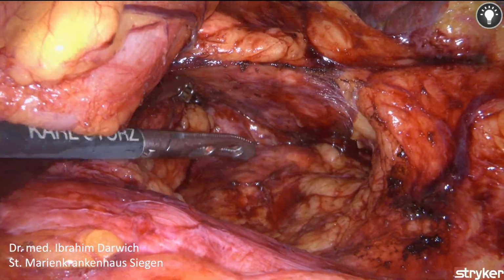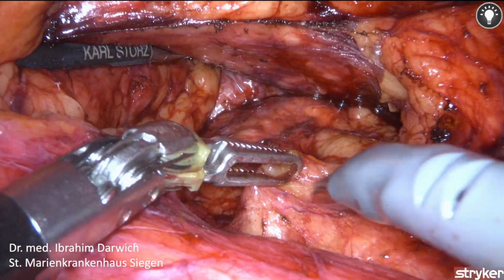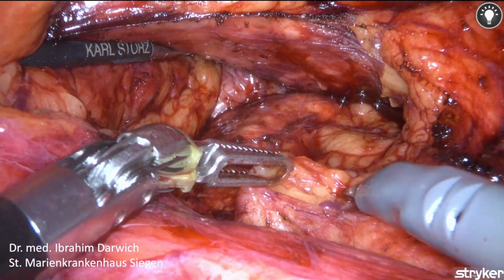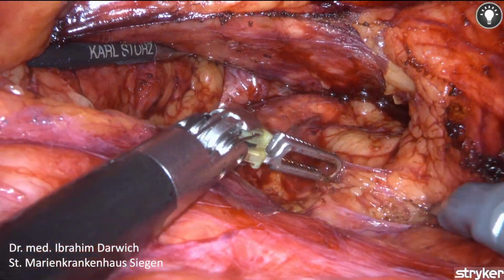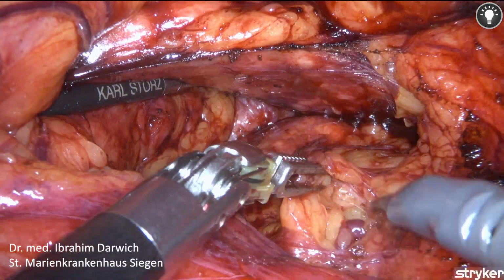The assistant is instructed to gently lift the pancreas using a non-traumatic instrument. This maneuver enhances visualization of the space containing the adrenal gland and enables the surgeon to perform precise dissection of the small blood vessels.